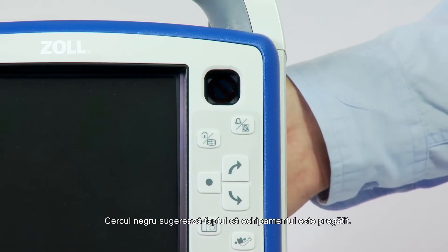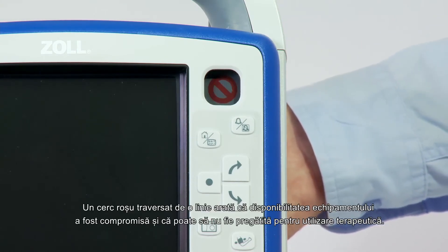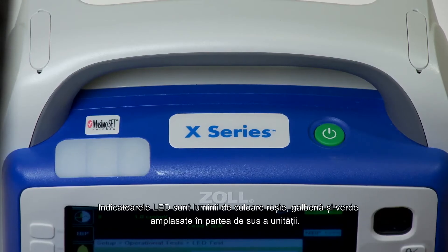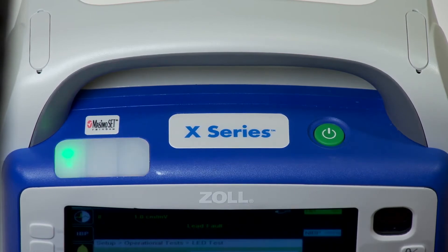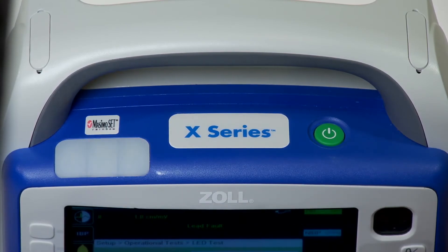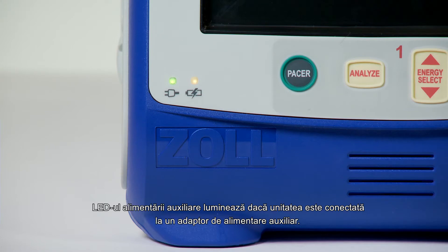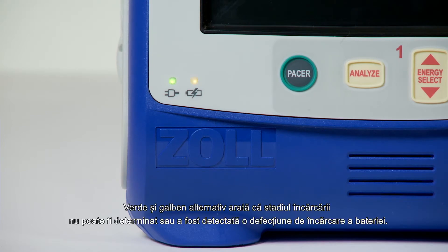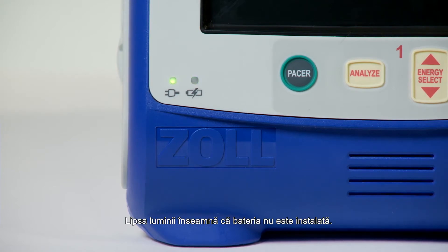A black circle indicates the unit is ready. A red circle with a line through it indicates that the unit's readiness has been compromised and that it may not be ready for therapeutic use. The LED indicators are red, yellow, and green lights located on the top of the unit — they are visual alarm indicators. They flash on and off when the unit is powered up and are used to indicate a patient alert, equipment alert, and data transfer. The auxiliary power LED illuminates when the unit is plugged into an auxiliary power adapter. The battery LEDs indicate the battery's status: steady yellow indicates the battery is charging; steady green, battery is charged; alternating green and yellow means the charged state cannot be determined or a battery charging fault has been detected; no light means the battery is not installed.